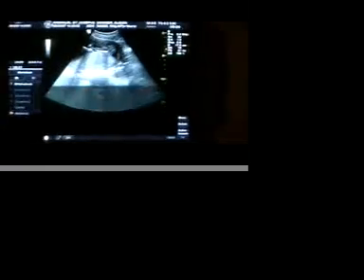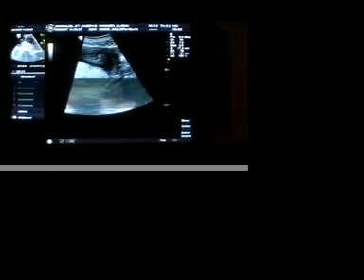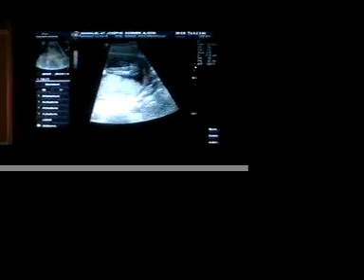Based on the due date, so let's see if you can see again at the bottom. So you can see a little bit of space, that dark space in between the legs there. So kind of starting to get the baby to cooperate.